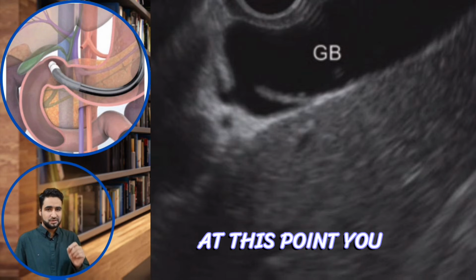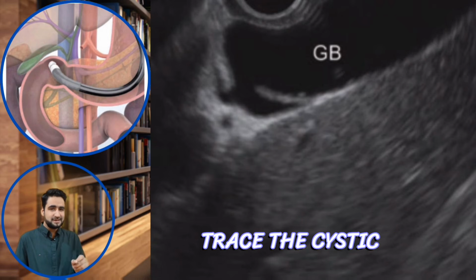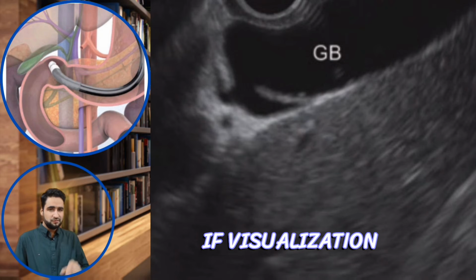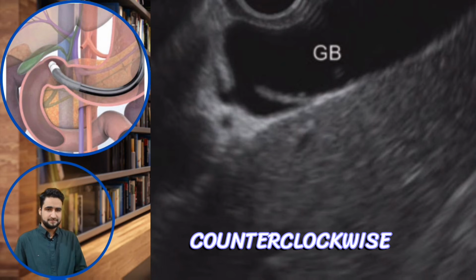At this point, you should be able to identify the junction where the bile duct and cystic duct join. From there, you can trace the cystic duct carefully and observe the gallbladder from the neck to the fundus. If visualization of the cystic duct is difficult, the gallbladder can be visualized or imaged if you turn the scope counterclockwise.